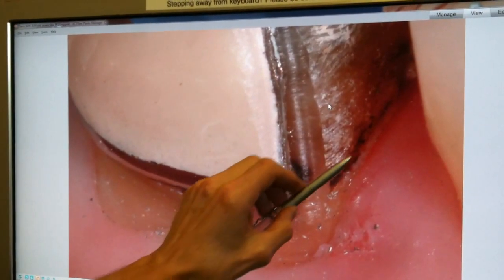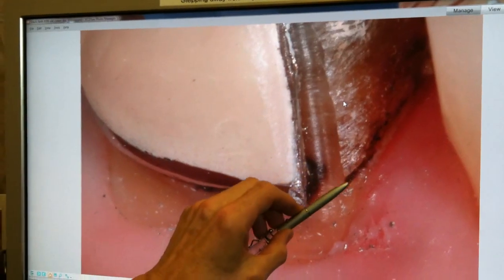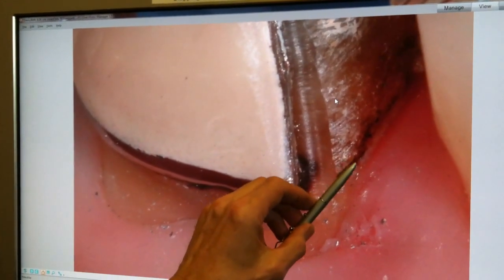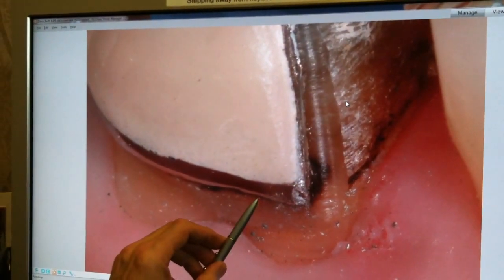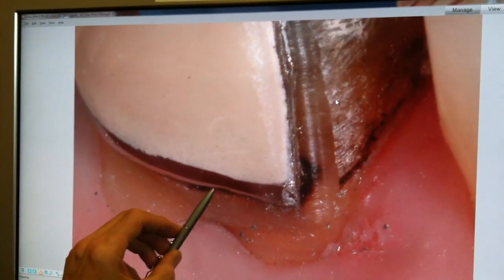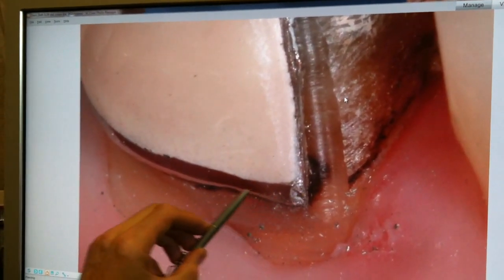Contrasted, you can see on the front side of this area where the cement, which is this white material up here, has disintegrated and left a stain, but the tooth structure underneath appears to be totally intact. How would you tell the difference between this area and this process going on with this crown in place? Be very difficult, if not impossible. But once I see this area and I can get an instrument tucked in here, we know on an old crown that we're going to see problems with this cement like this.